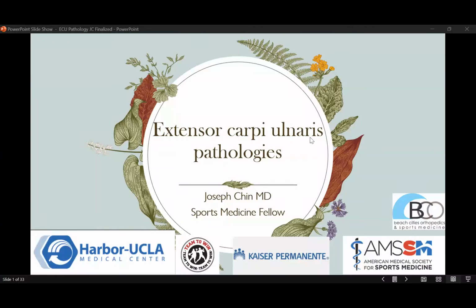So today I'm going to speak about the Extensor Carpi Ulnaris pathologies that we can see. I was lucky enough to find a case within the short time frame that I was assigned this topic. So let me go to the next slide.